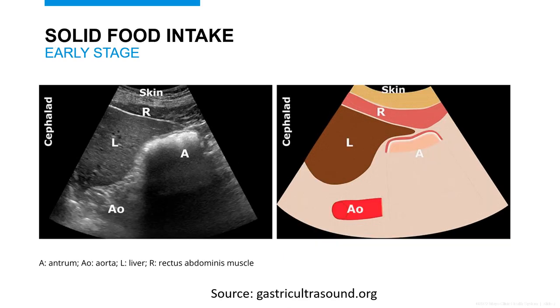Here we have a full stomach. We know that this patient recently ate because the solid material and air intake while the patient was eating is preventing the ultrasound beam from penetrating deeper into the abdomen. So we have the frosted glass pattern, as appreciated by the white line that fades into black dropout on the ultrasound screen. The antrum also appears distended with thin walls.